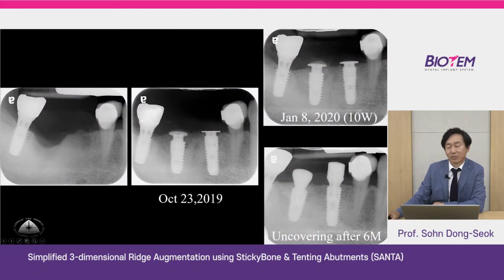This is before. This is post-op. This is the technique. You can see the bone of the Santa, or the head of Santa. The uncovering was done after 6 months. Because of the COVID crisis, the uncovering was delayed. Wow, you can see the beautifully, vertically augmented ridge here.